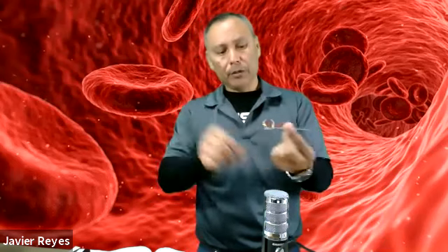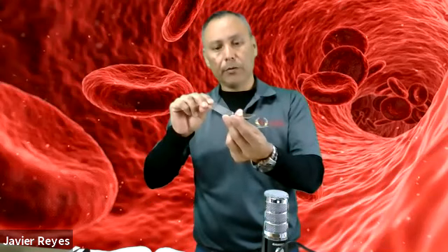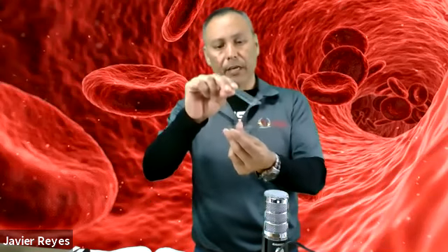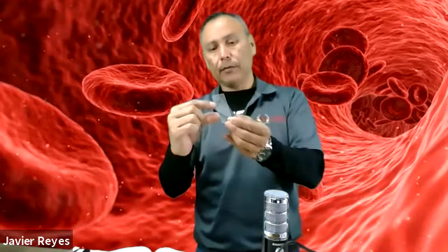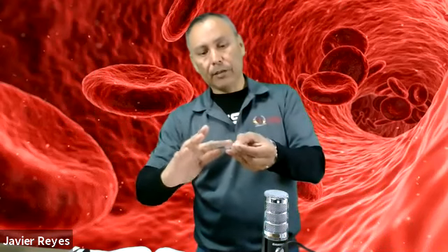Turn it over, and with the second slide, you're going to come in here at about 30 degrees and push it forward. You want to create a feathered edge. You're going to create a smear that is acceptable. What is an acceptable smear? The smear has to fill about two thirds of the slide. It has to go from thick to thin, and the edges have to be feathered out. It means it kind of vanishes out; it thins out from thick, thin, thin, thin, thin.